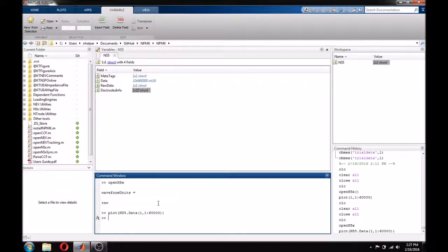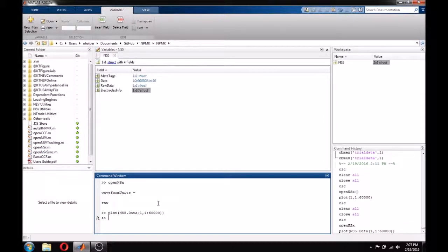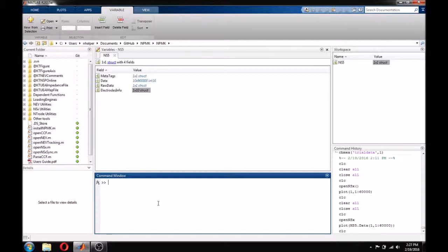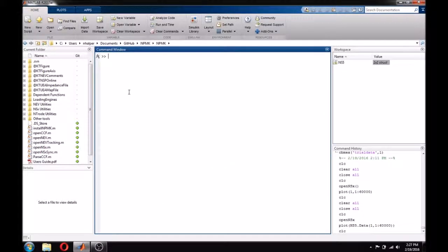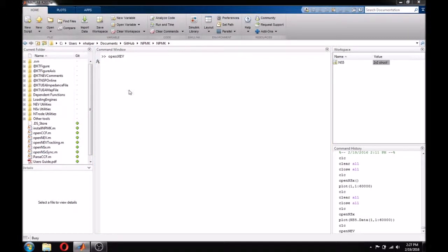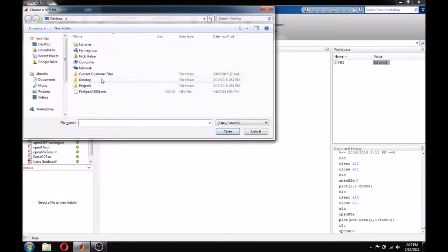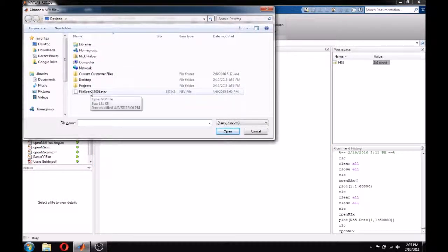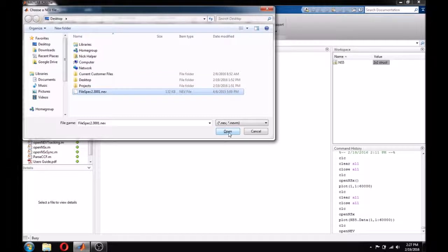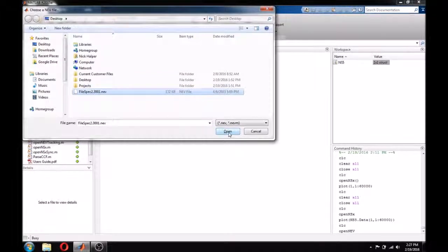With the basics of OpenNSX covered, let's take a look at the slightly more involved OpenNEV. Just like OpenNSX, we can open an NEV file by simply typing OpenNEV. This also opens a file dialog in which we can choose our NEV file. I will choose the NEV file that is paired with the NS5 file that I opened earlier.